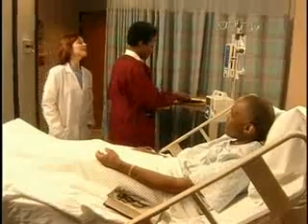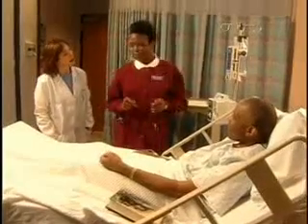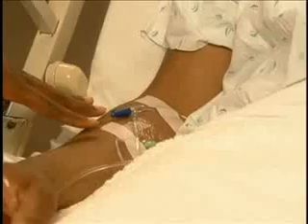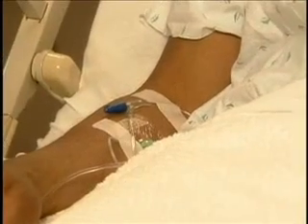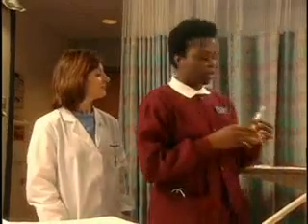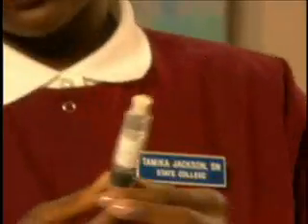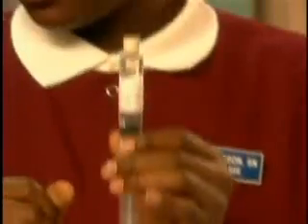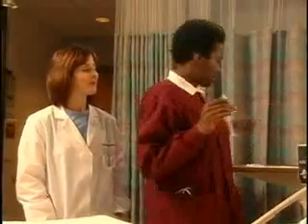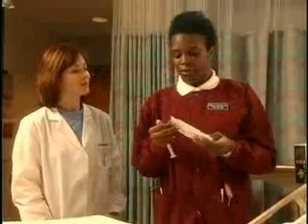Excellent. Did you check to see if the antibiotic is compatible with the primary IV solution? Yes, I already checked, and it's compatible. So, Mr. Nixon, I'm just going to check your IV site for inflammation and infiltration, and it looks fine. So, we're ready to get started. I'm going to check the syringe for air bubbles, and I don't see any. But if I did, I would expel the bubbles from the syringe. Next, I attach the syringe to the mini infusion tubing.